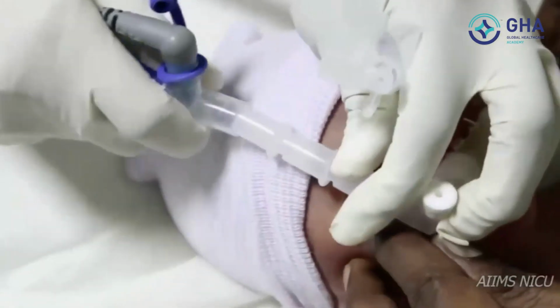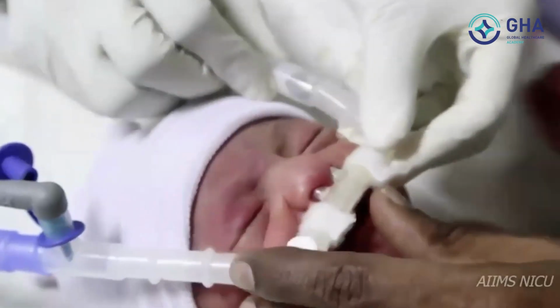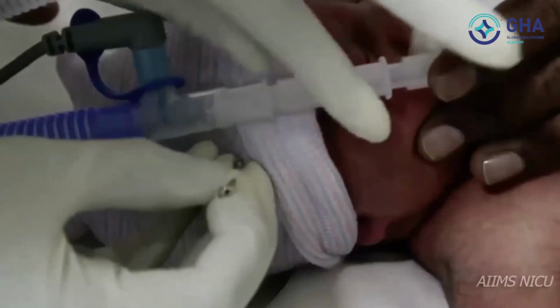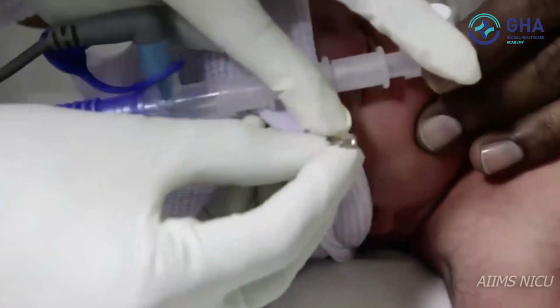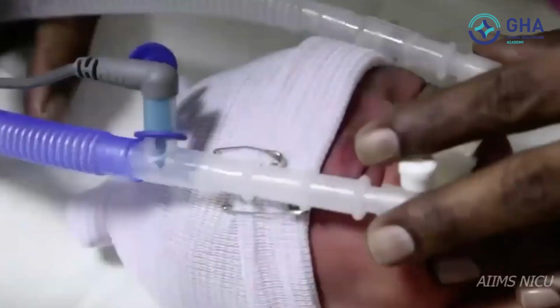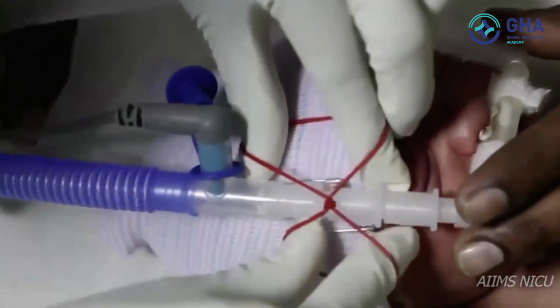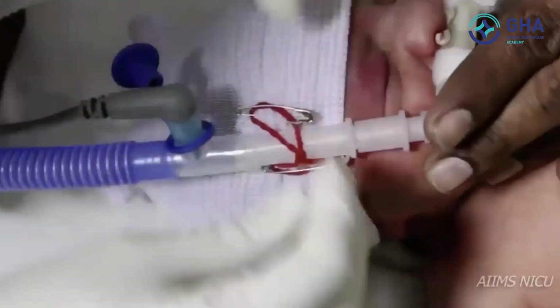Connect the limbs of the circuit to the ends of the nasal prongs. Now fix the connectors to the cap on either side using the safety pins and the rubber bands. The rubber bands are made in a figure of 8 for fixing the connectors onto the cap.